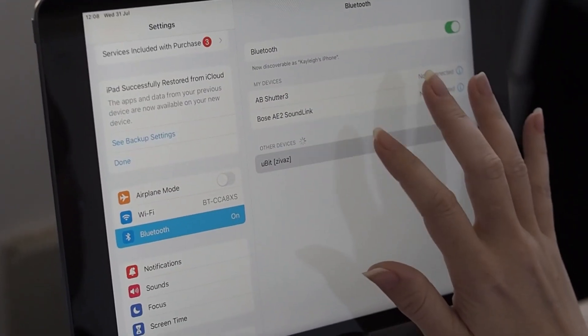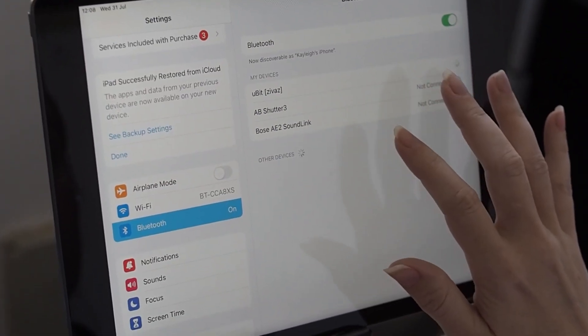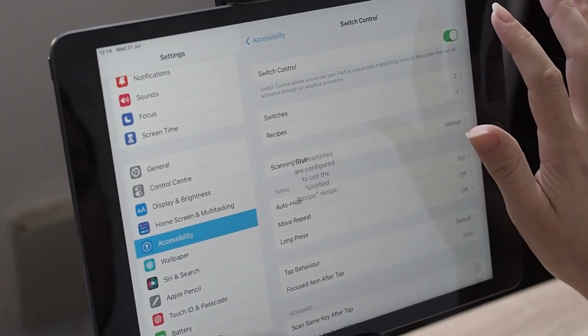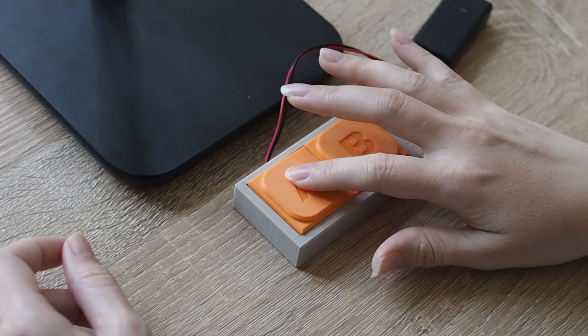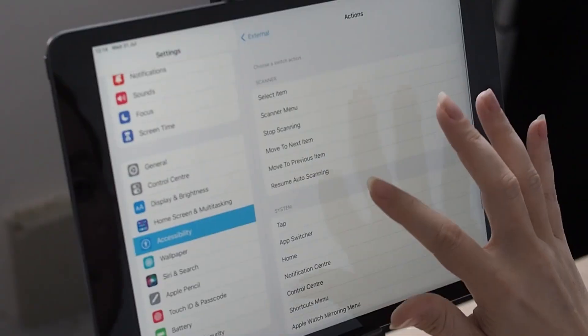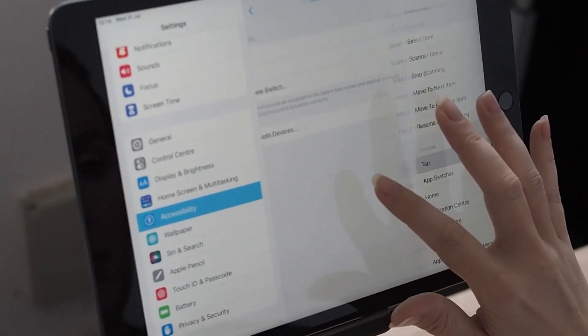Simply connect TAP to your device via bluetooth and turn on switch control, then map the buttons to move to next item and TAP.